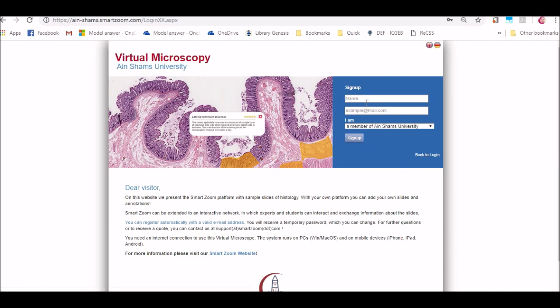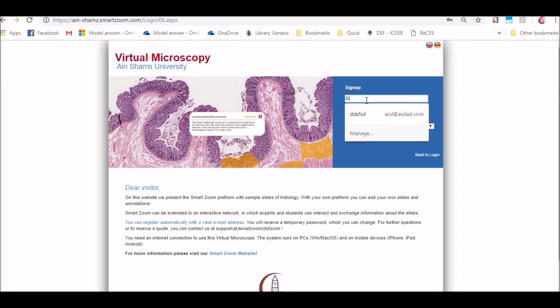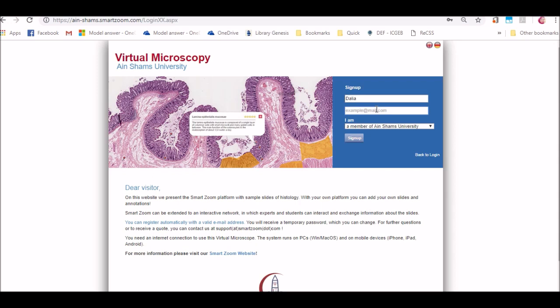In the sign up form, fill in your name and your official email address. Your official email address is at med.asu.edu.eg and please if you don't have it, refer to the IT unit in your faculty. Any other email address other than your faculty email address will not be accepted.